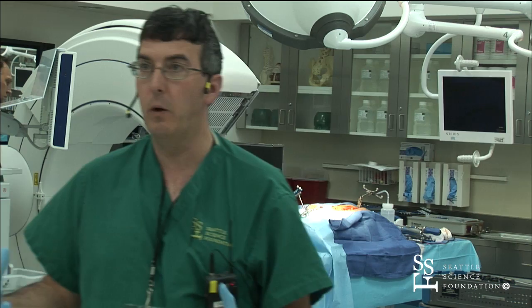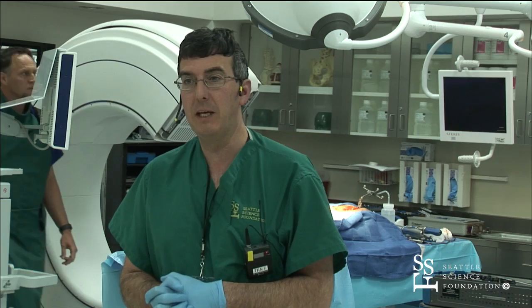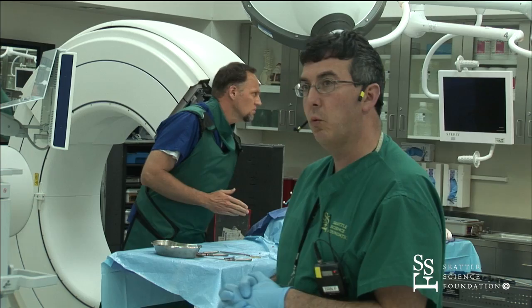We've gotten a lot of adult scoliosis patients. And when you get adult scoliosis patients, they have this huge fusion mass and they're very hard to figure out exactly where to put the screws, because we used to do foraminotomies — it took forever. You get down there and you invariably get a CSF leak, or you could put hooks into the fusion mass, which kind of didn't hold as well as pedicle screws.